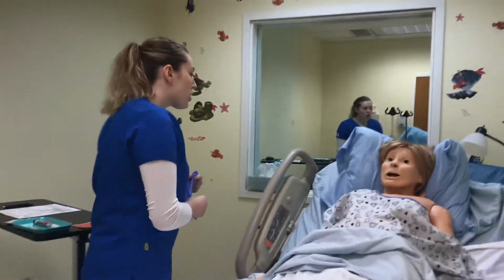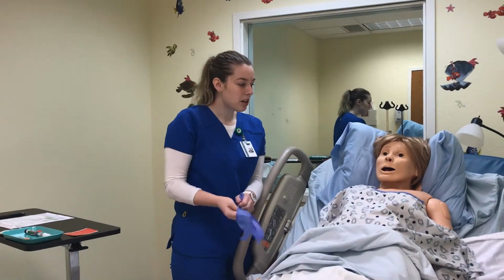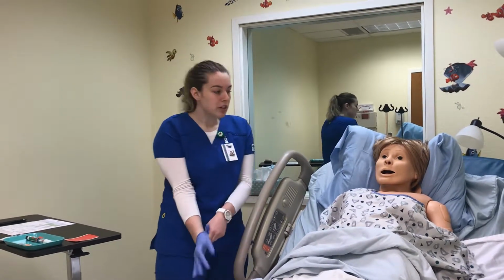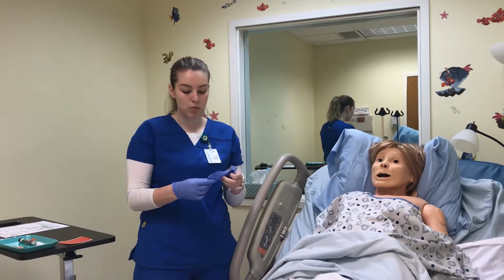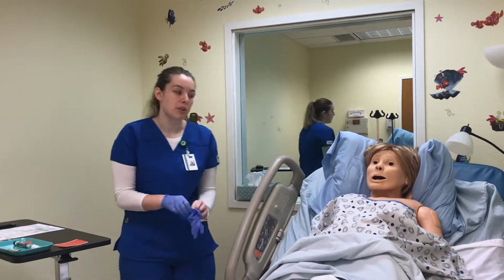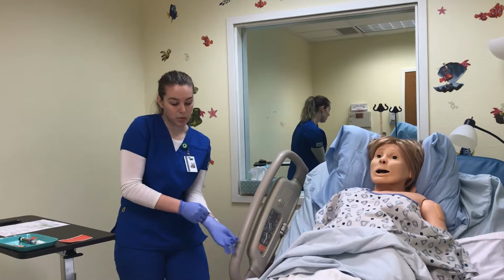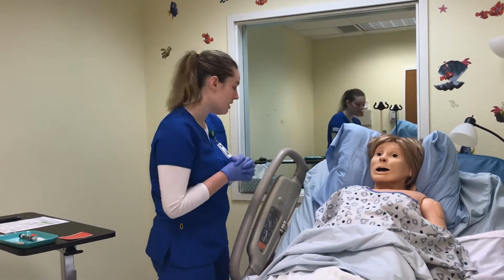So now your supper is here. Does it look like a good supper? Are you going to eat your supper? Yeah? Okay, perfect. So I'll go ahead and give you your insulin. Do you usually give injections to yourself at home? You do? Okay, and where do you usually give them? On your abdomen? Okay, we will stick with that spot then. And I'll make sure I have 2 injections for you today, so we will rotate the sites to make sure there's no tissue damage from repeated injections.